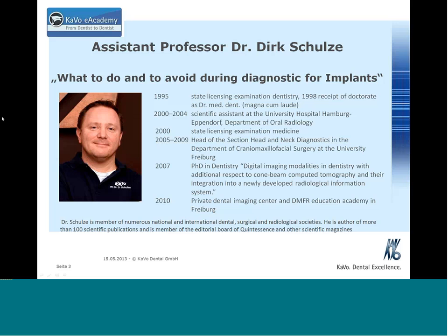So there could be artifacts again, and to overcome this situation, I can only recommend making some intraoral radiographs to control that. But as long as we observe these kinds of artifacts, there will be no solution for this question. Well, that means with one implant I can look around, but if there are two or more implants side by side, there will in all cases be a kind of signal loss, and that means there is a metal artifact.